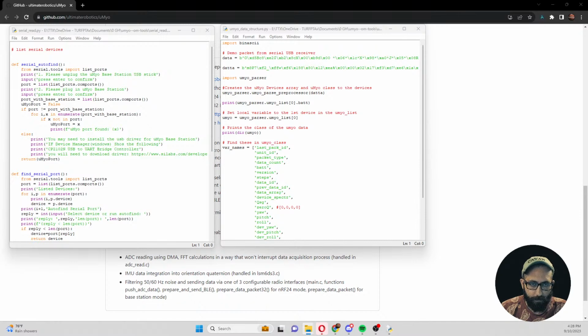GitHub, Open Muscle, demo. So we're going to do omcapture.py. Open with IDE.